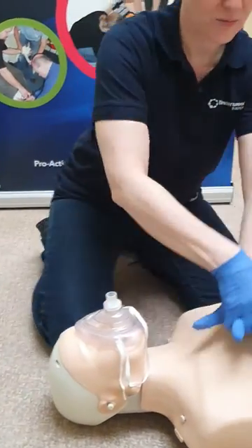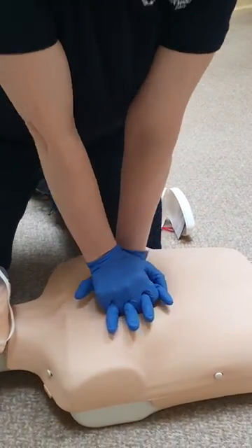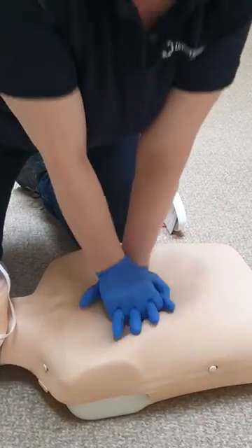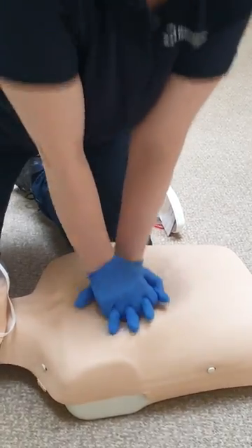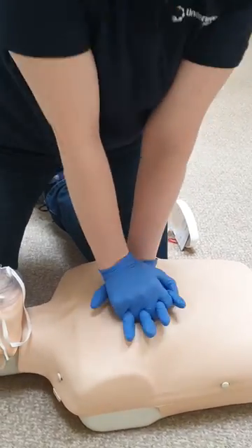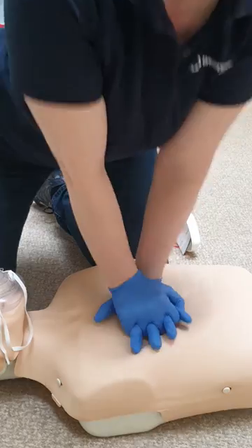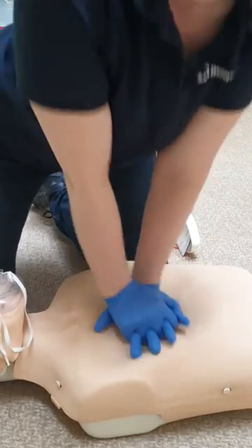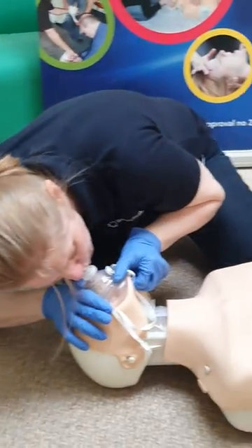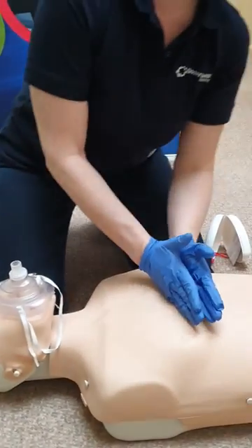If you're doing compressions and ventilations with CPR, we're straight into 30 compressions, and then onto two breaths for CPR in the outside, everyday public setting rather than a hospital setting. Unfortunately I can't count and squash and talk at the same time — so 28, 29, 30. And back to compressions.